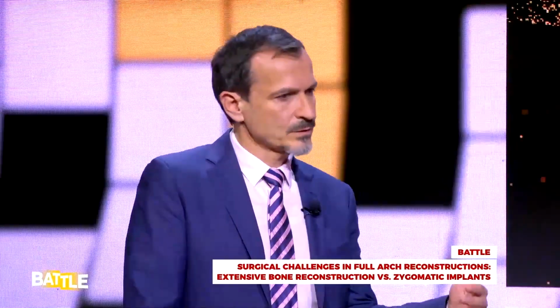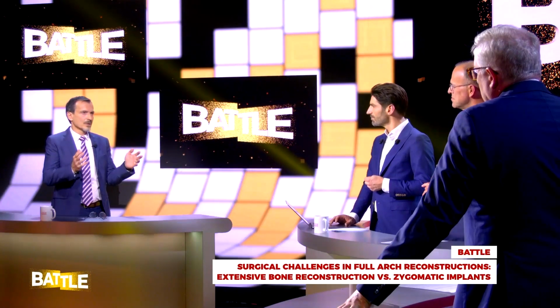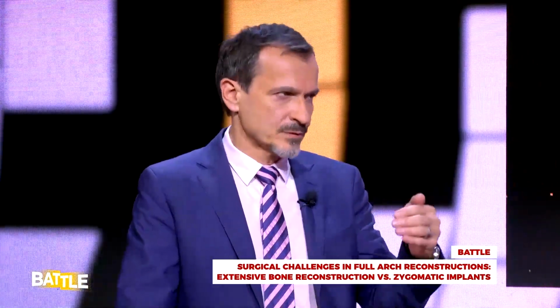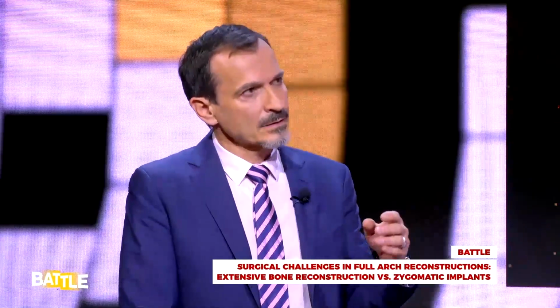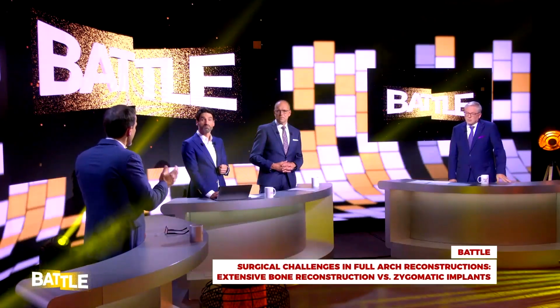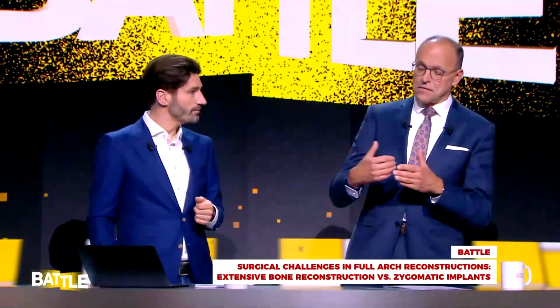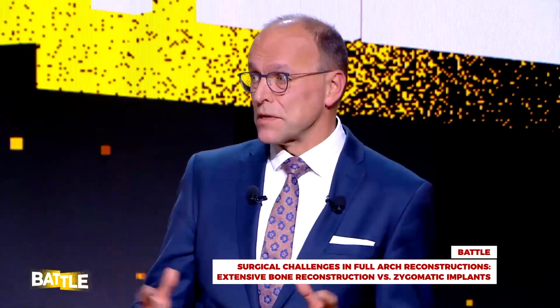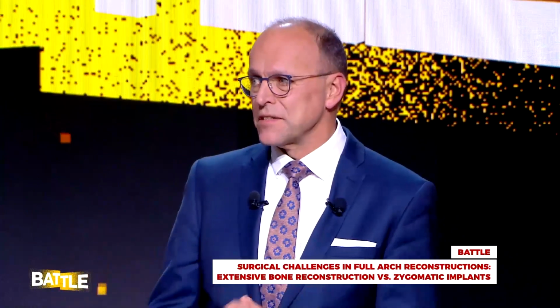But of course, before we do the entire surgery, we have a kind of planning and an outcome, and we can say, okay, this would be the prosthetic outcome of the patient with lip support and the length of the teeth and so on. So at the end, I guess we can more or less reconstruct everything with the prosthetic. No limitations. Prosthetic device, yeah. But that's what people say sometimes, that where the implants enter the palate on the palatal side, that's unfortunate for the prosthodontic reconstruction, limiting the space for the tongue, with phonetic problems, cleansability problems. Exactly. How do you tackle these problems?